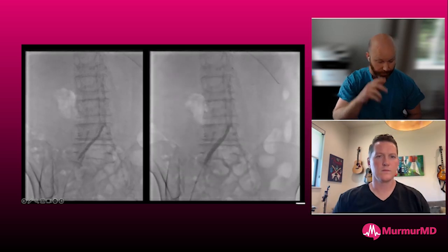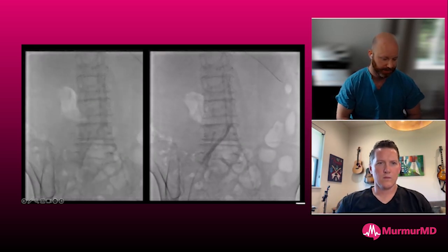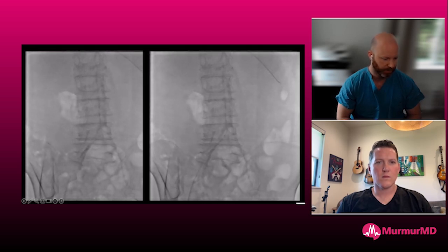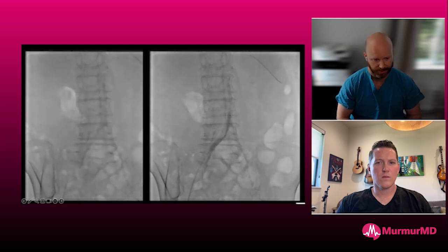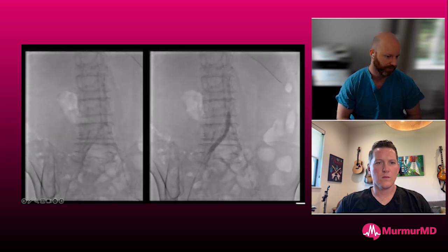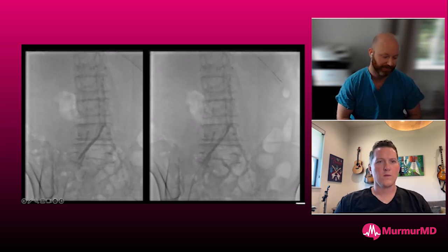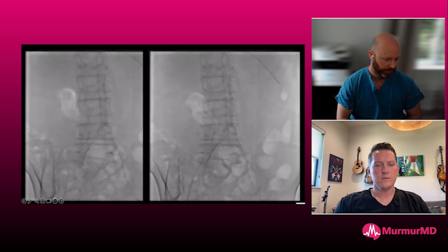It works with ECMO because the flow from the ECMO T piece is very high, right? It's several liters per minute of direct flow through the side port, so it overcomes the resistance. But when you put in something like an Arrow for anterograde perfusion and connect it simply to the side port of a peel-away, where you already have a repositioning sheath, an Impella, and your companion sheath through, you really don't have enough flow to adequately perfuse the leg in a meaningful way.